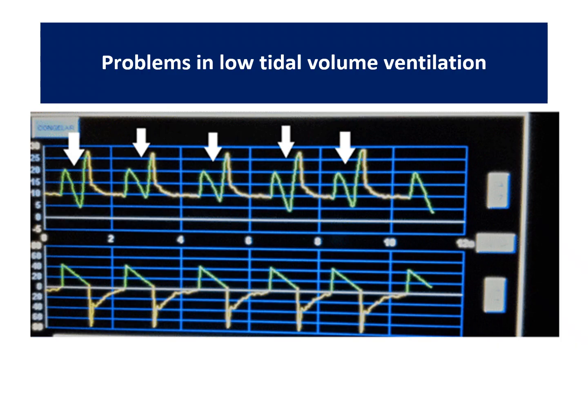You can see actually a little bit of flow asynchrony in many of the patients. In this patient it is gross. Sometimes if the inspiratory effort is too much, more than the trigger you have set, it can lead to double trigger. Like, you can see breath stacking, one breath on top of another, which can be injurious to the lung. But if it is a mild flow asynchrony, you don't have to worry about it. You know, it will settle eventually when the patient's ventilation is improved.